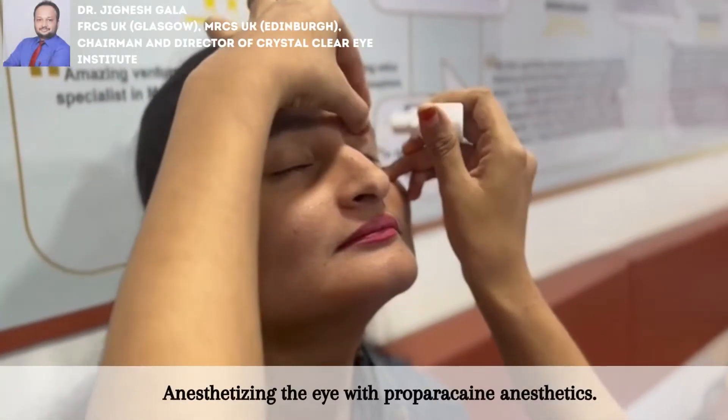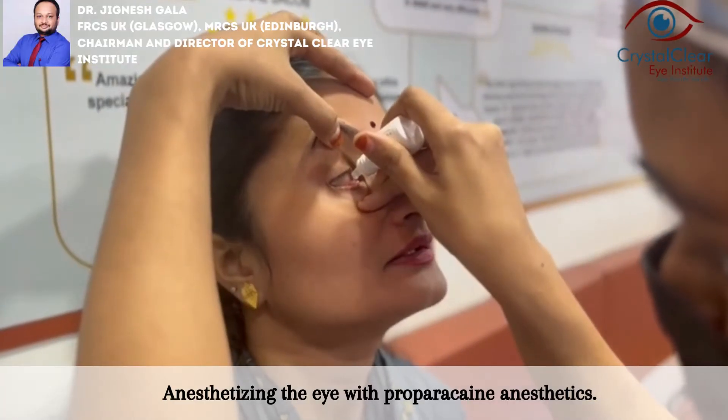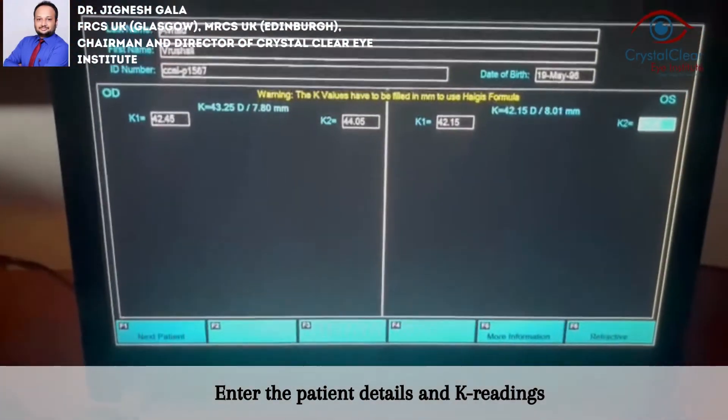The immersion technique requires the use of a Prager scleral shell, or a set of Aswanic or Hansen scleral shells. The patient lies supine, looking up at the ceiling, and the scleral shell is placed between the eyelids and centered over the cornea.